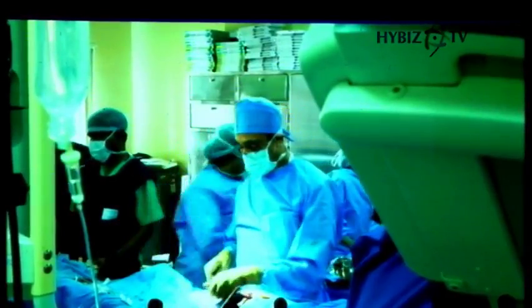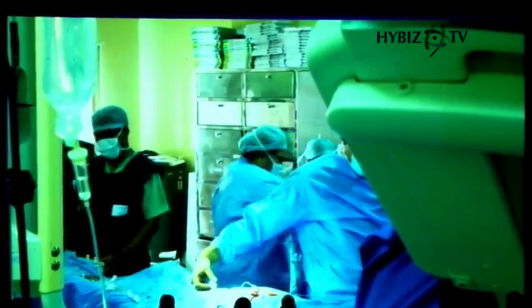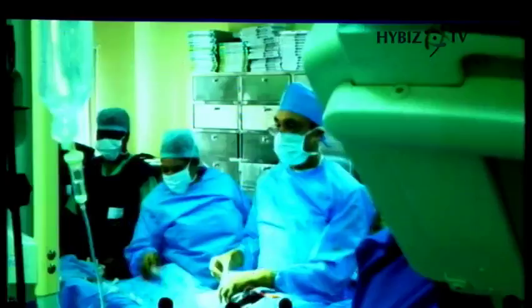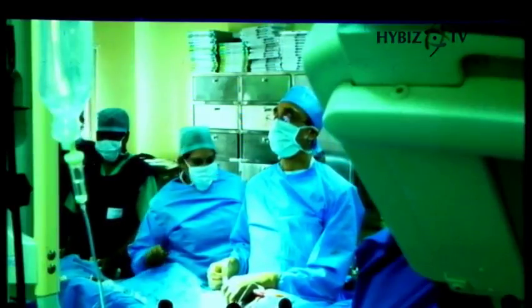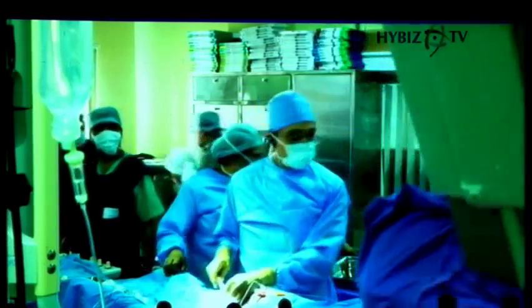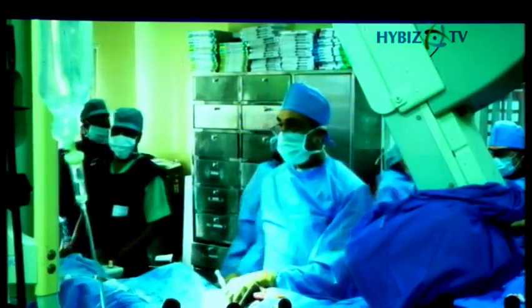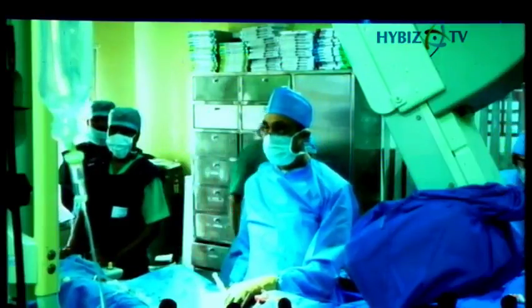This is a 60-year-old male, diabetic and hypertensive with class 2 angina, who underwent PTCA stent to the LAD in 2009. He has a normal LV with normal renal parameters. The index angiogram, as you can see on your screens, shows a proximal LAD ISR CTO.